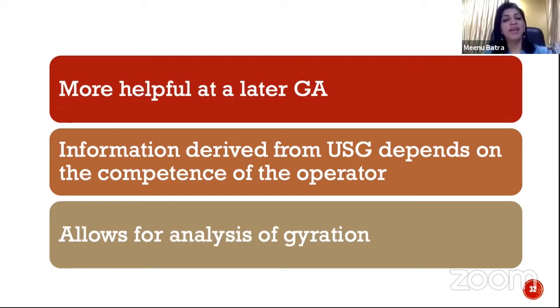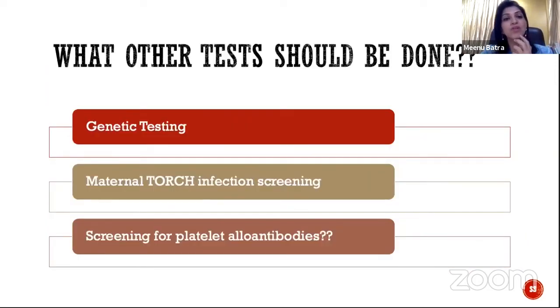Yeah, so that's a very valid point. I think the utility of MRI and the amount of information is a lot dependent on the person who's done the ultrasound scan, versus the person who's going to conduct the fetal MRI for you. So moving on to the next question, that's to Suresh sir. Sir, what are the other tests that you would want to do in this patient?